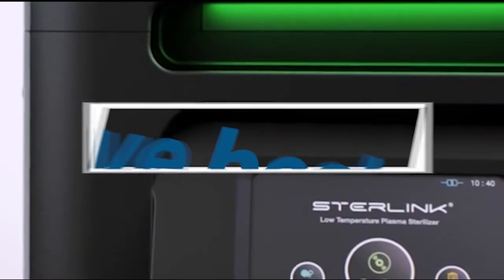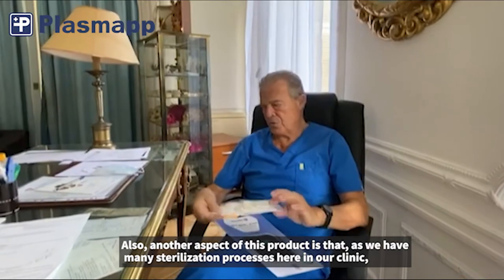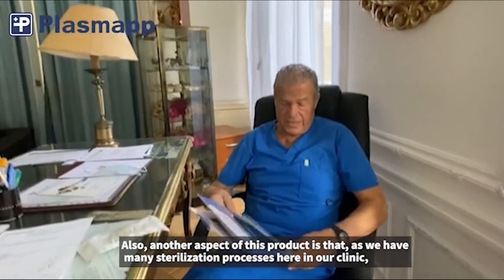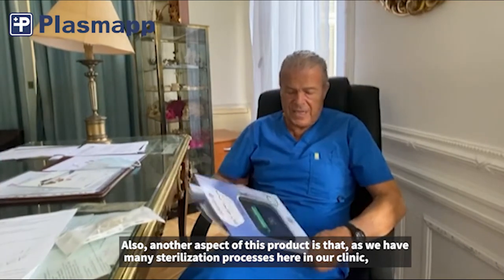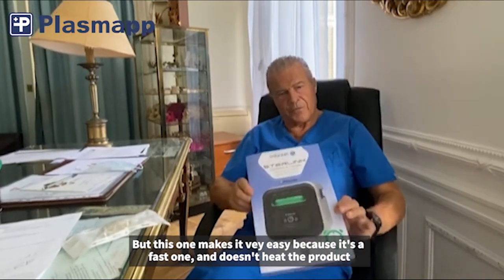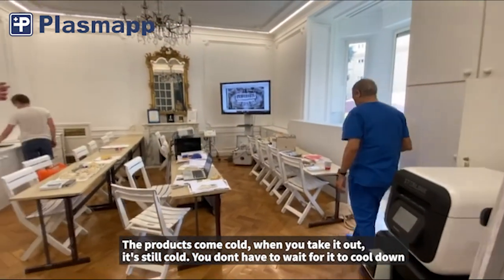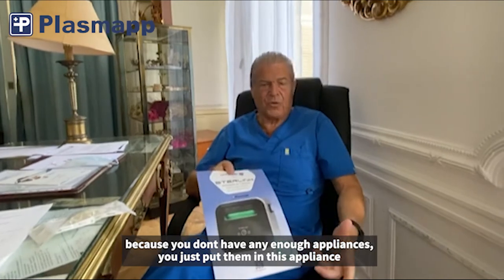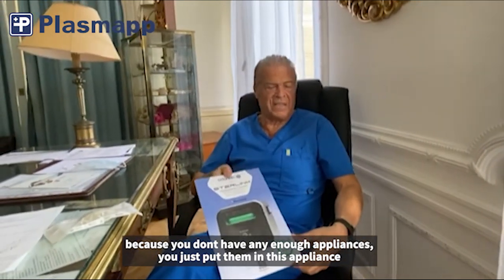Another very nice aspect of this product: we have many sterilization processes in our clinic, but this one is very easy because it's a fast one. It doesn't heat the products — they go in cold and come out cold. Even when you have different appliances to sterilize, it's done in five to ten minutes.